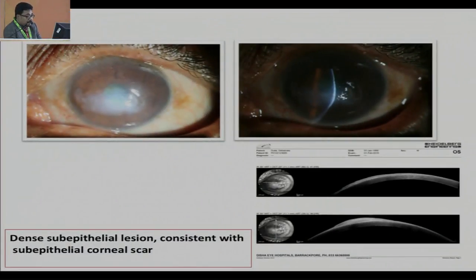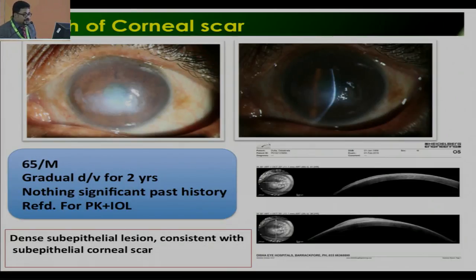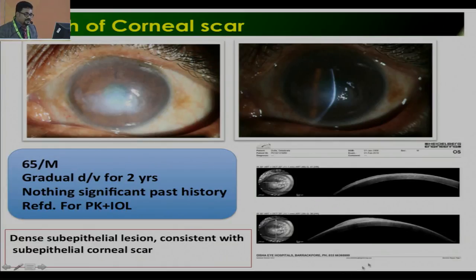Another patient: a 65-year-old male with gradual visual deterioration for two years, nothing significant in past history, referred from a general ophthalmologist for PK plus IOL. On anterior segment OCT, we could see dense subepithelial lesion with the underlying cornea perfectly clear — consistent with subepithelial corneal scar. A diagnosis of epithelial hypertrophy was made. The patient ultimately underwent just epithelial debridement along with diamond burr polish and did not need any corneal grafting, even though apparently it looked like the patient needed a PK plus IOL.